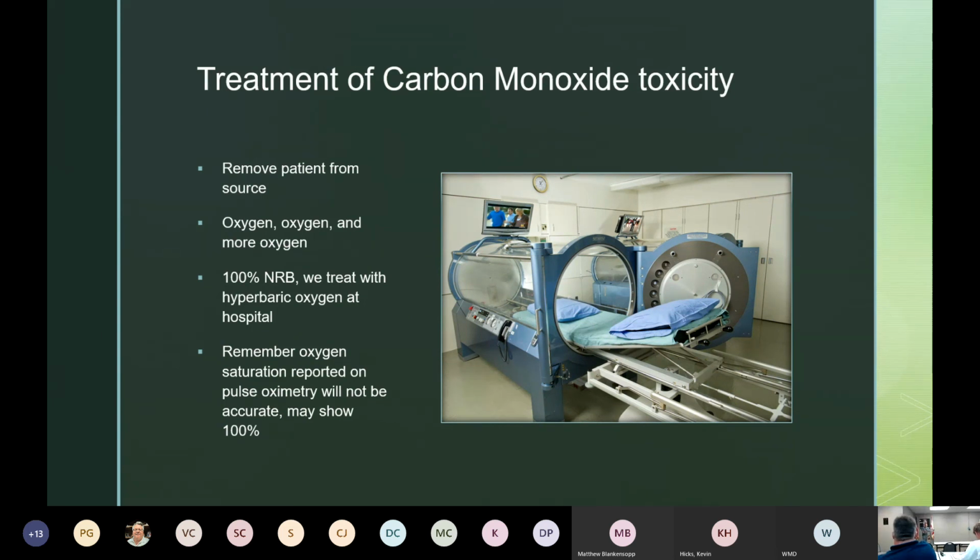Yeah. So the other point there is if you're working for a fire service or if you're an EMS agency standing by at a structure fire, it's important to do firefighter rehab that includes SpCO, which means a rainbow-capable fingertip sensor. Right. And also we've seen over the years that a lot of guys that work for multiple fire departments, which is true for most of our firefighters here at Centerpoint, can have consecutive days of firefighting and build up a CO level that becomes dangerous over the course of 2 or 3 days. I don't know if there's any literature on that or not, but we've seen instances of that anecdotally here.